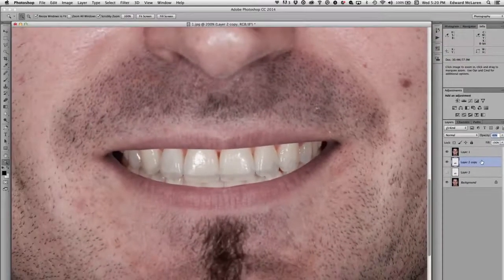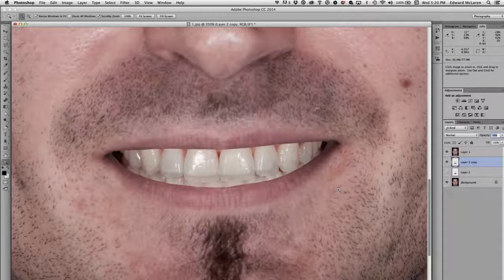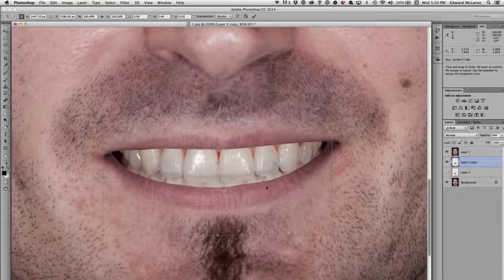We're going to change one of them, and how do we change it? With him sitting there, I'm going to say, okay, sir, you don't want orthodontics. Everybody says that today. I'm going to show you what I think I can do just restoratively. So I'm going to bring up Free Transform again, Command or Control T. That box comes up, and I'm going to move this over a little bit. I've got to bring your midline back over just a hair. I think I can do that. I think I can move your midline. I'm okay with that.